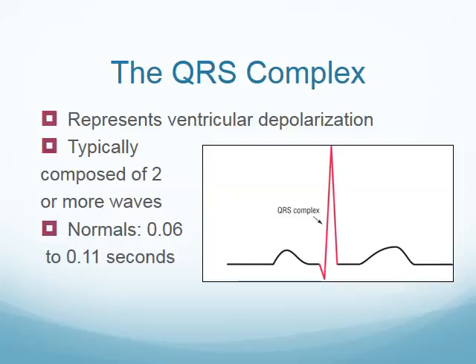Not always going to have a QRS complex specifically. Actually, the QRS complex is kind of a misnomer because generally.